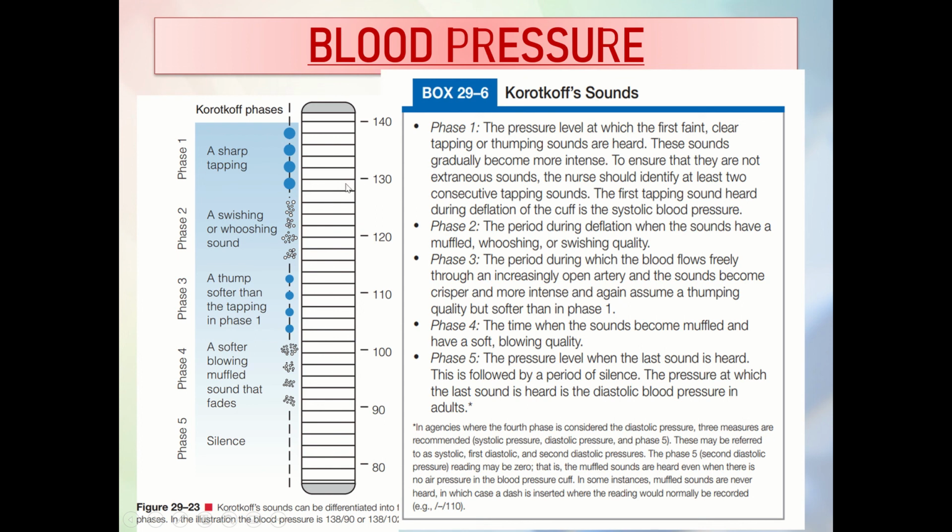So, you have to take note kung saan mo siya unang narinig. Or for example, inangat mo yung pressure up to 160, tapos narinig mo yung unang sound sa 140, then that would be the systolic pressure, and that is phase 1. So yung phase 2, the period during deflation when the sounds have a muffled, whooshing, or swishing quality. Phase 3 naman, the period during which the blood flows freely through an increasingly open artery, and the sounds become crisper and more intense, and again assume a thumping quality but softer than in phase 1.